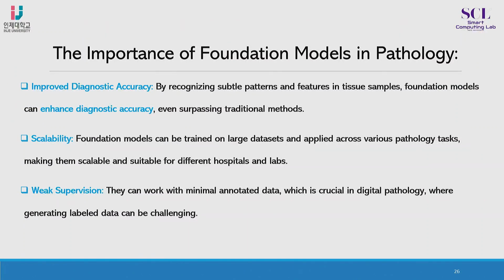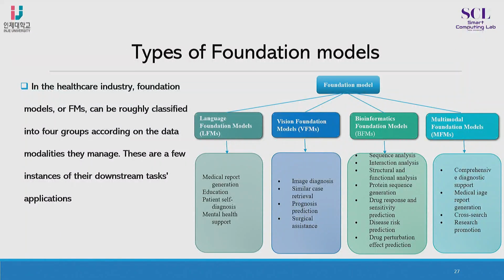So the importance of foundation models in pathology: improved diagnostic accuracy, as I mentioned, and also scalability and weak supervision. These are some important features of foundation models. Here you can see different types of foundation models. We have language foundation models, vision foundation models, bioinformatics foundation models, and multimodal foundation models.